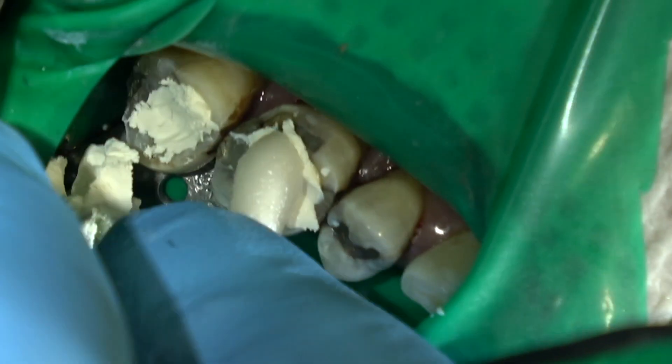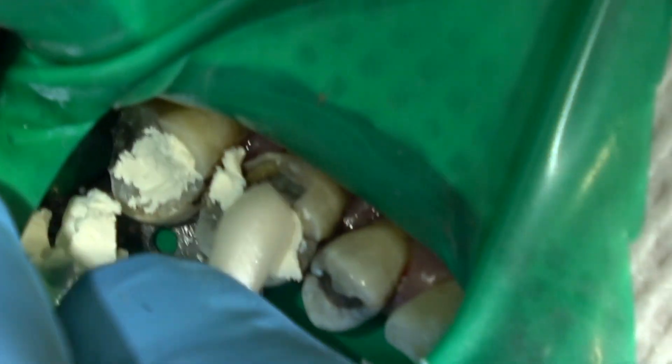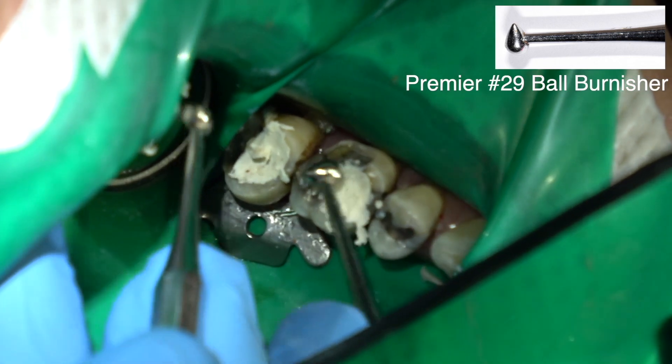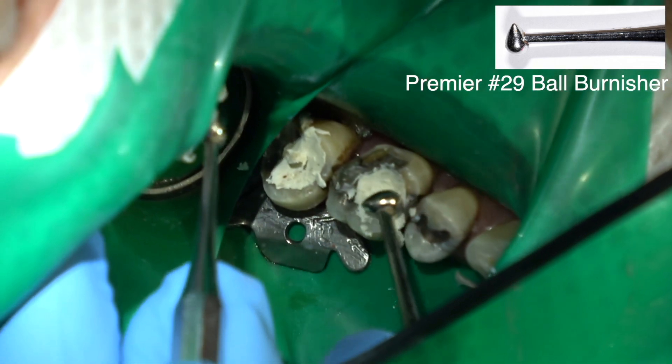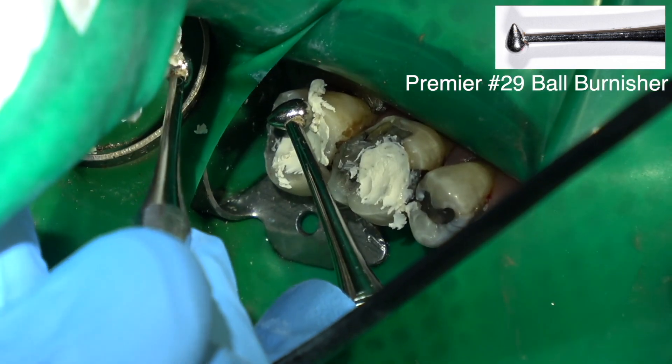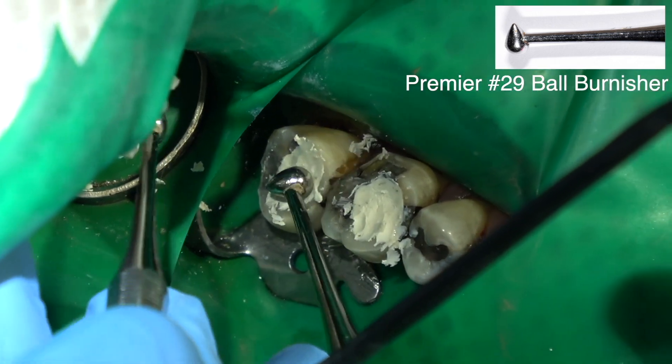You can place a composite buildup if you want to. I've just always used this because it's so simple. But you need to mix it. You can see that's pretty firm. You want to mix it densely so that it's nice and firm and not gooey.